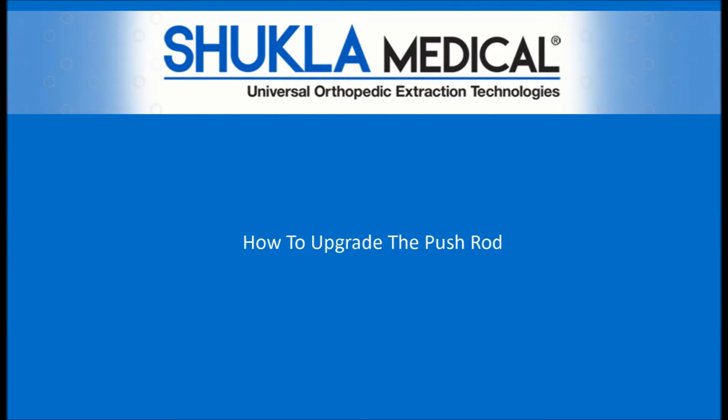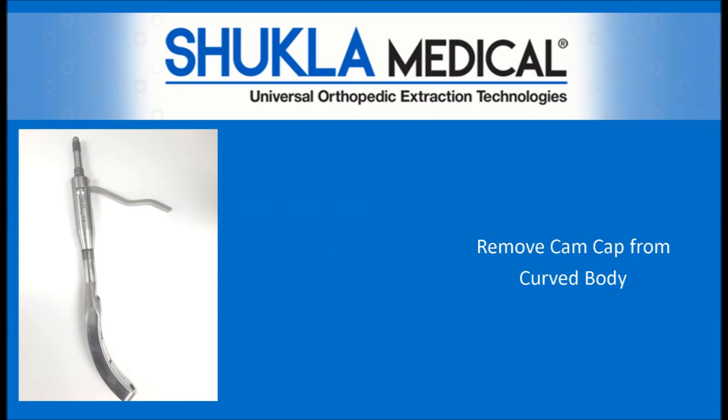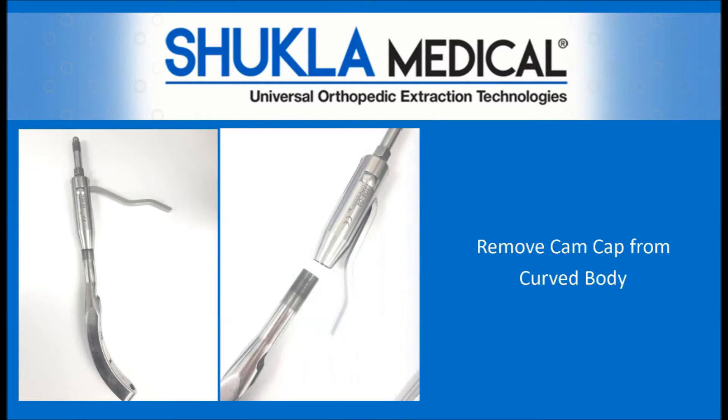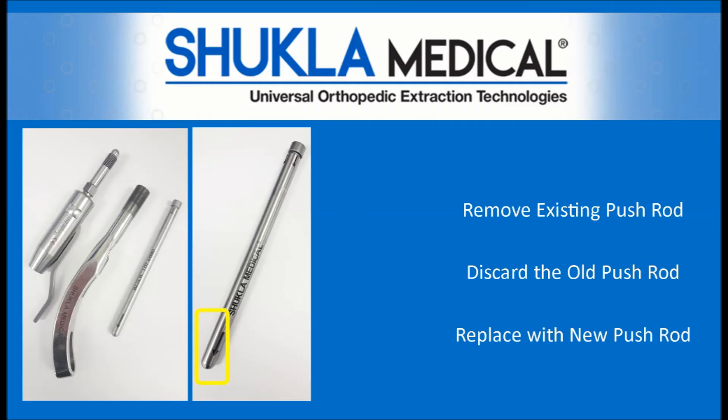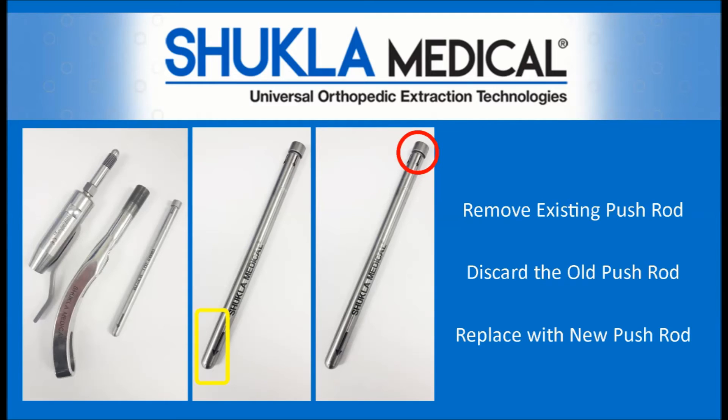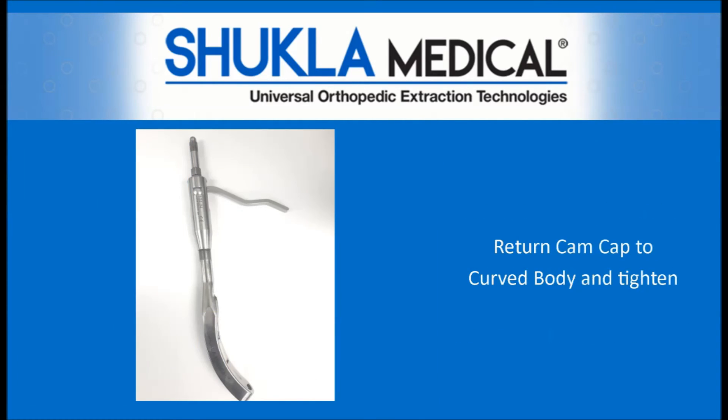To replace the pushrod, follow these simple instructions. Unthread the cam cap of the hip extractor from the curved body. Once opened, remove the existing pushrod, then discard it. Replace with the new pushrod using the arrow as a guide. The new end cap is going to ensure that you don't get that wrong. Then return the cam cap to the curved body and tighten.